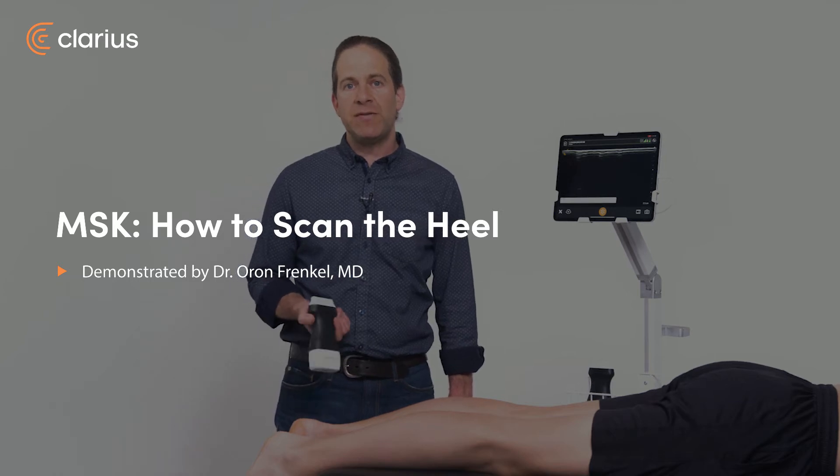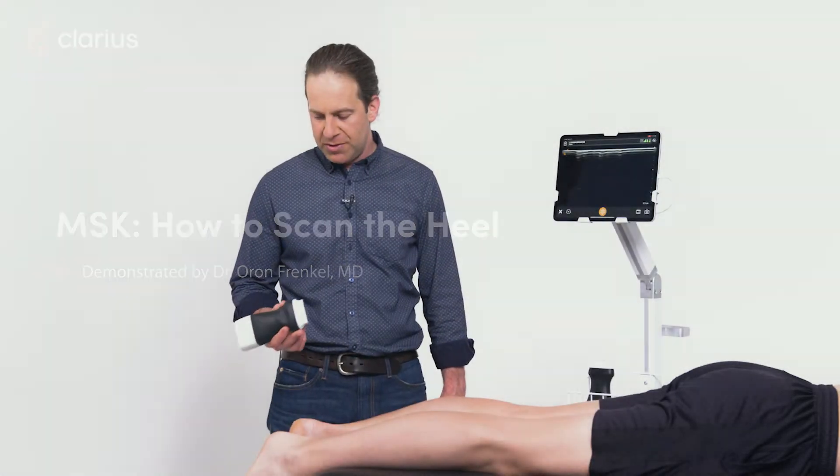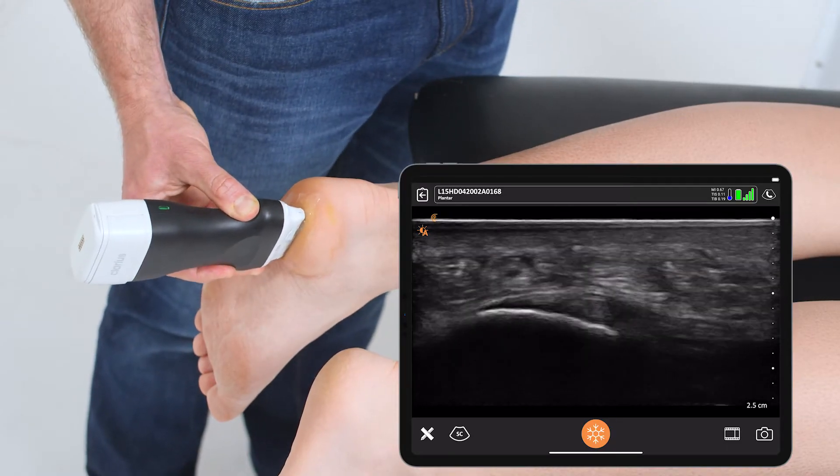In patients presenting with heel pain, the plantar fascia can be quickly identified and measured with ultrasound. Using a linear scanner on a plantar or MSK preset, I'm going to place it in a longitudinal fashion right over the calcaneus.